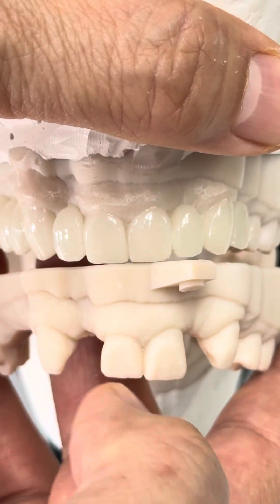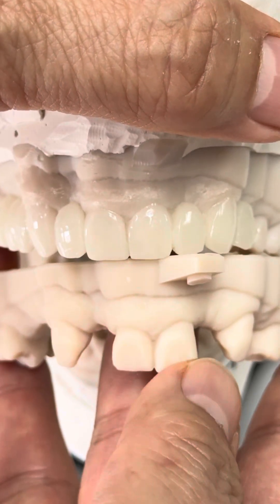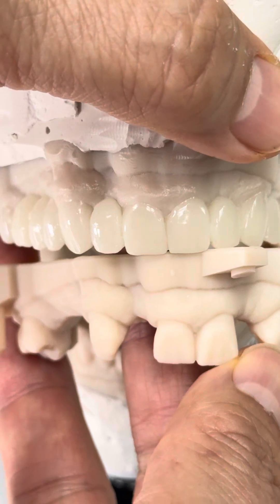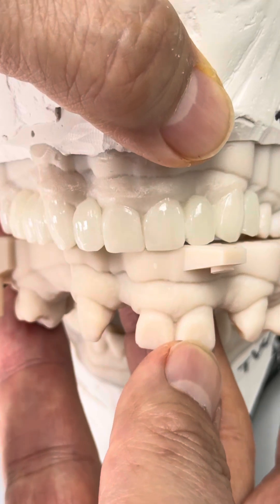This is another wax-up — fill in the space which is bone loss. Concentrate on that one. Make it slightly longer than the canine; actually, we increase just a little bit vertical and then get the buccal corridor.